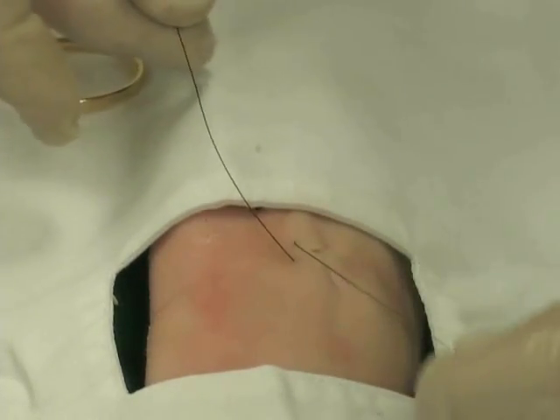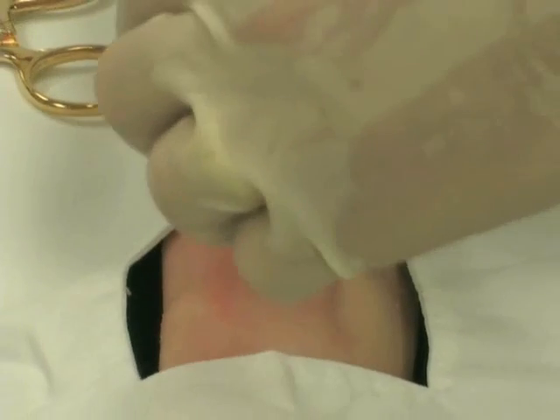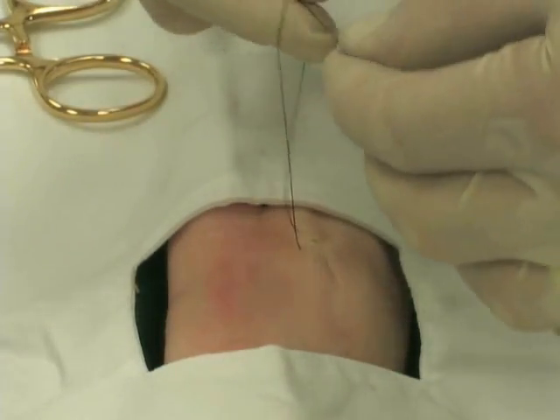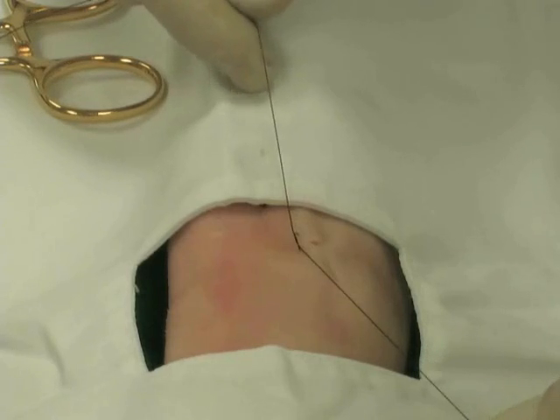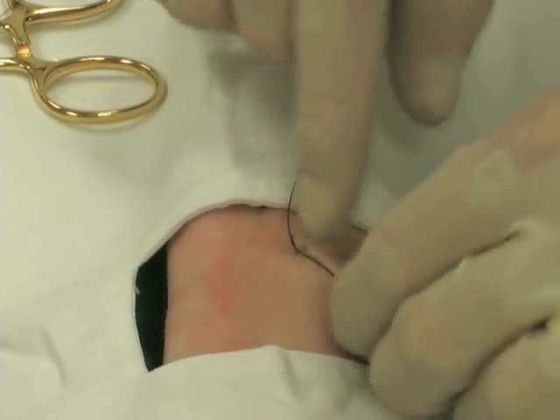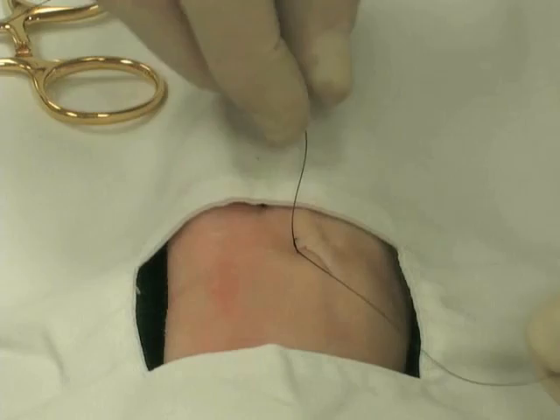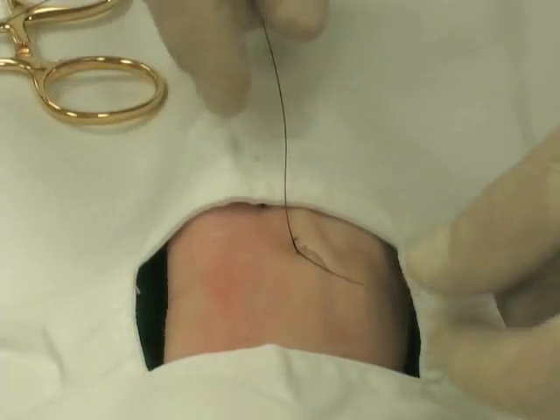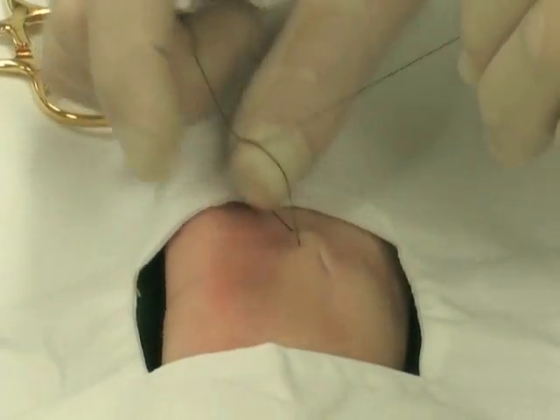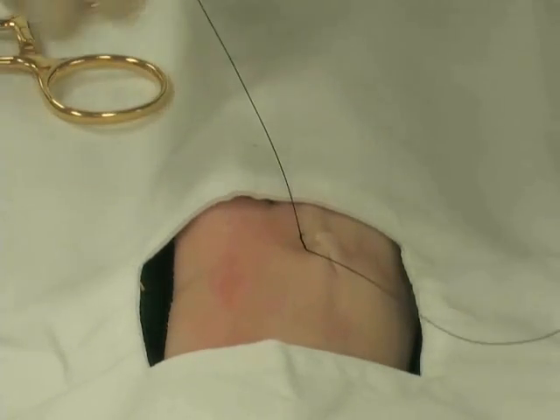You'll cross the top string above and the shorter string below, with the longer string over your index finger. Take the shorter string and pull it over your index finger, rotate your hand, pinch, and then pull. You'll see how the knot lies flat. Here you can see that the corner stitch would avoid some necrosis to the tip of the flap, which might otherwise face vascular compromise with a series of simple interrupted sutures. We'll throw a second time to have a surgeon's knot, and you may appreciate how this will stay better until you place your second suture.